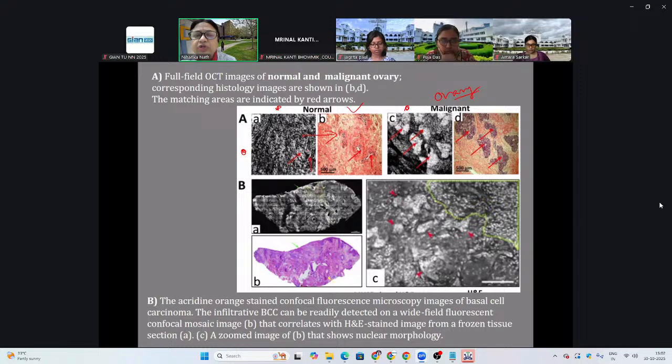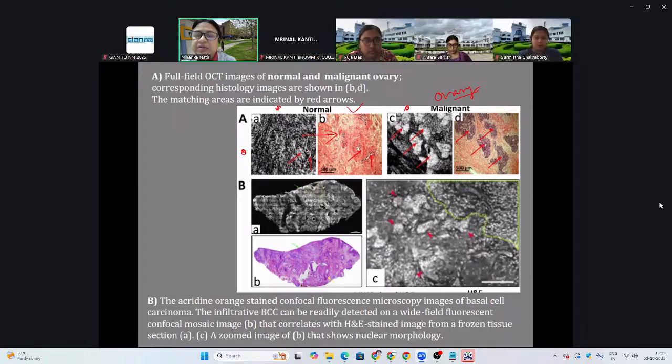What you will have are patches of immense growth and other cells. If this was a bone tissue you would see matrix, but this is not a bone tissue, so that's why it's not here. Ideally, like I said, in cartilage you will have your extracellular matrix. But in a tumor, just remember, it's a lot of cells.